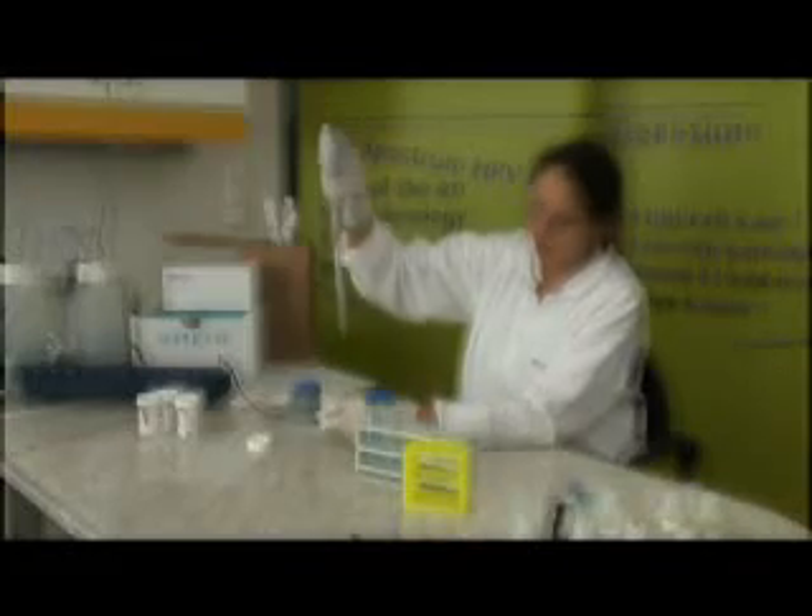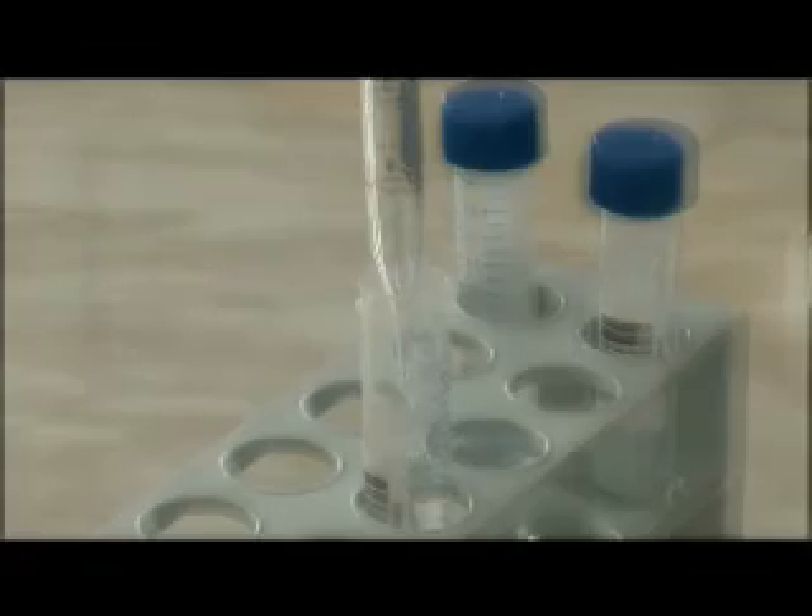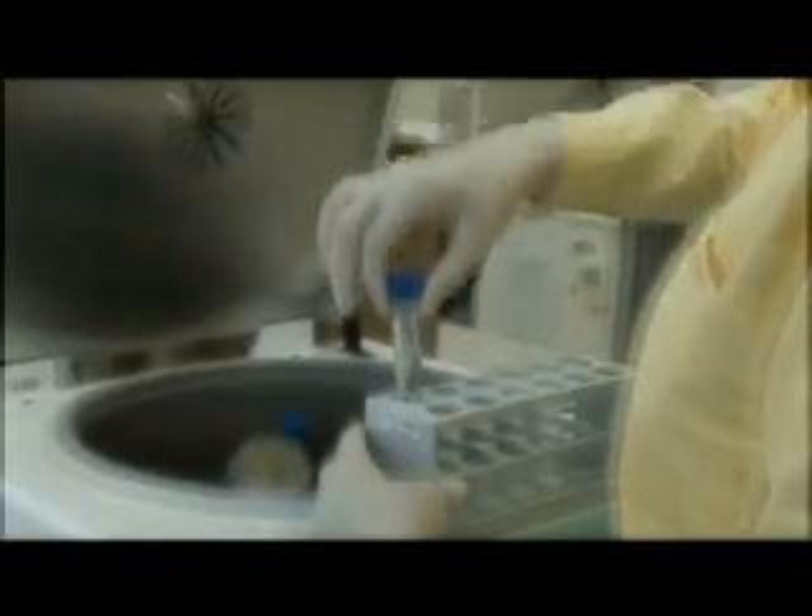Welcome to this video presentation about the GENO-ID Full Spectrum HPV Assay. This 15-minute video will show you how to use the product safely and effectively.